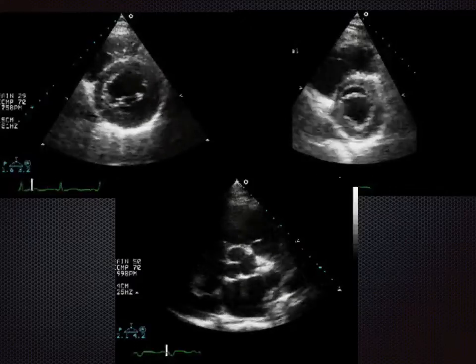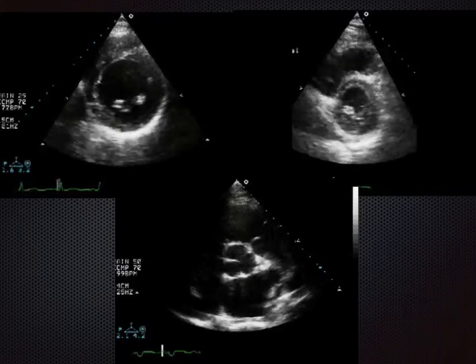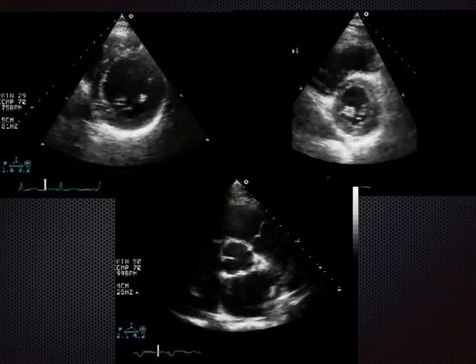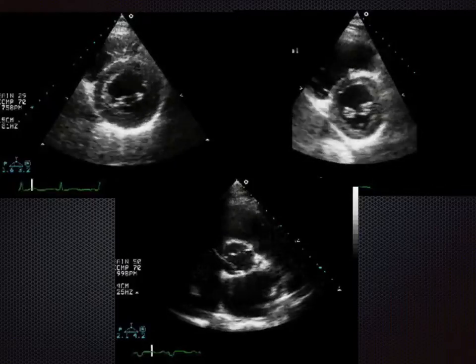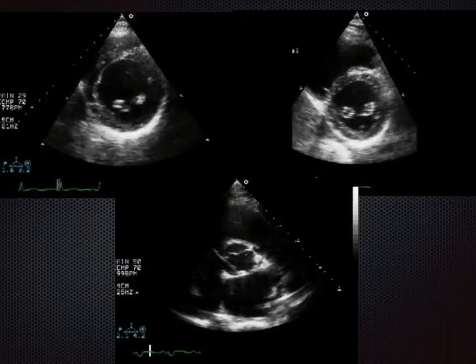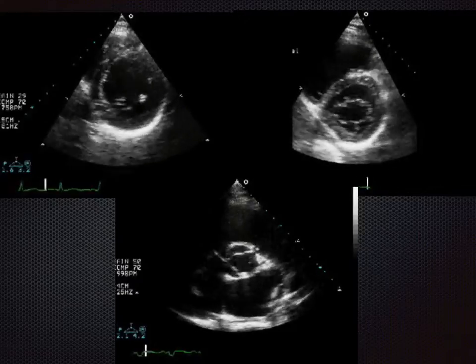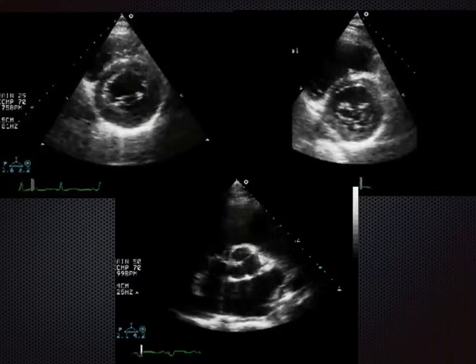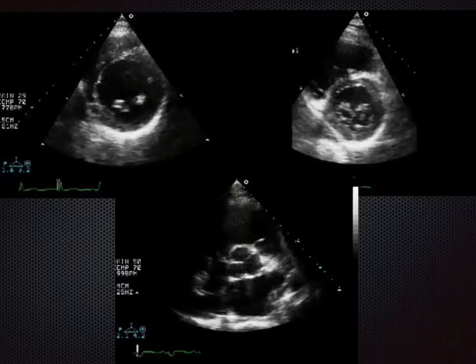Okay, let's have a look at the parasternal short axis views. Remember, this is another good one to look at all the particular walls of the left ventricle in cross section. Now, it doesn't show you the whole of the inferior wall or anterior wall, for instance, but it shows you that particular slice. So, same thing again. During systole, the left ventricle is thickening by about 30-40%. Normally it should be about a centimetre in thickness in its resting phase, and it's thickening by 30 to 40% during systole.